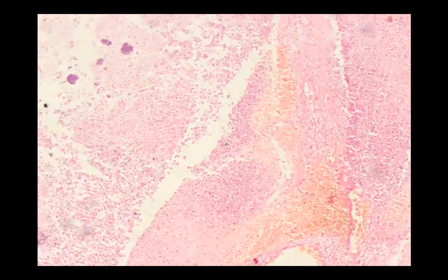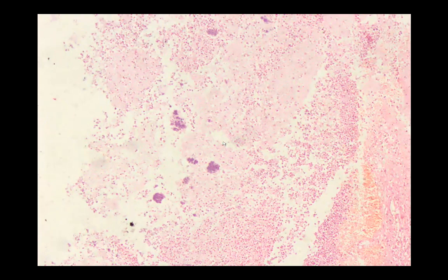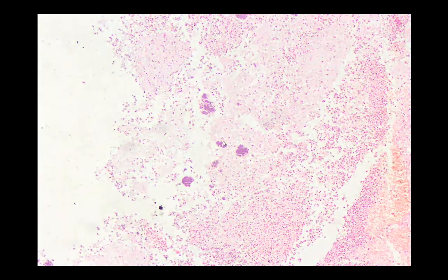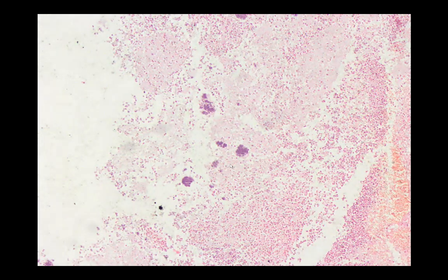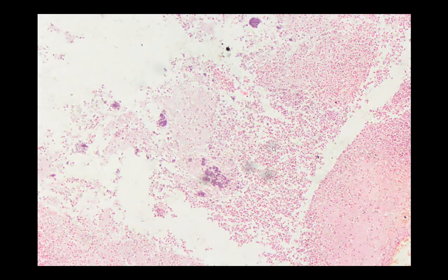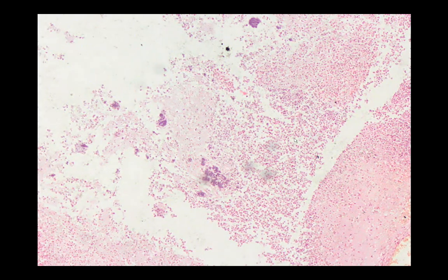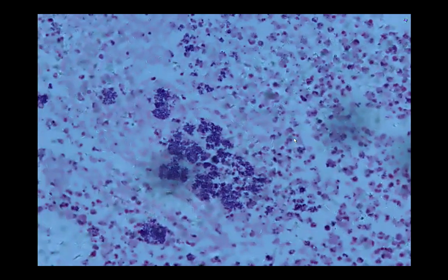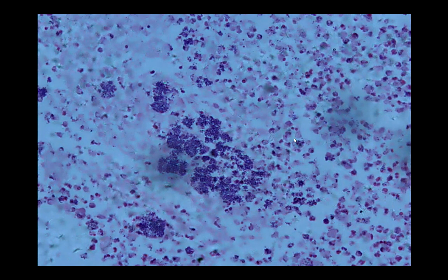One important feature here is that you can identify the presence of organisms. Let's go first with the low-power magnification so that you would appreciate — these are bacterial colonies on low-power magnification. These are accompanied by a lot of inflammatory cells.